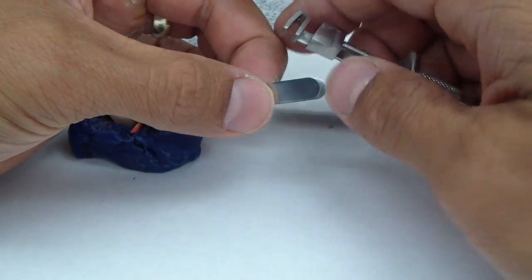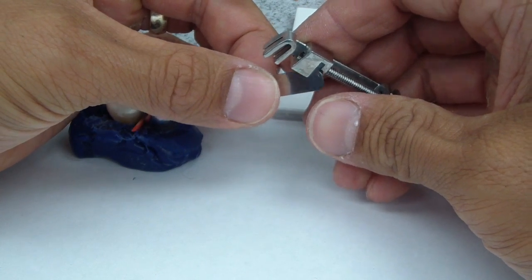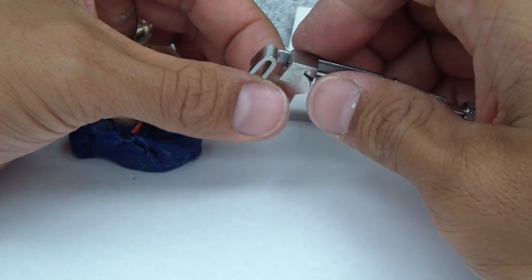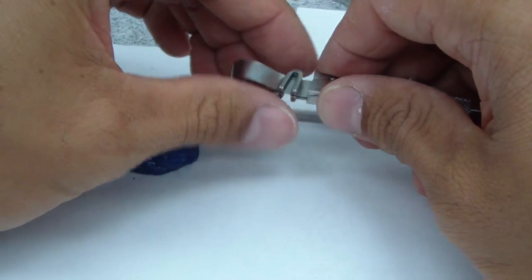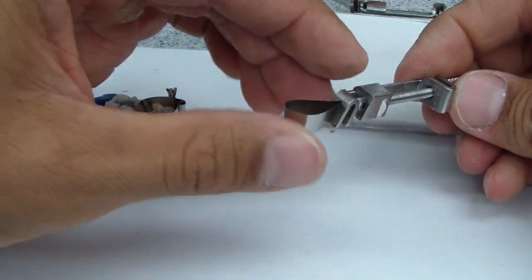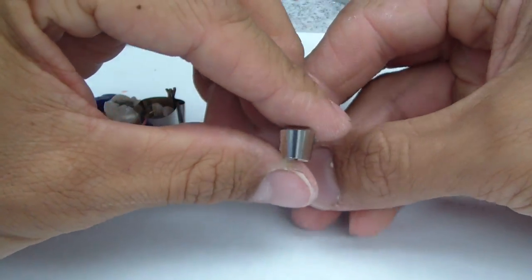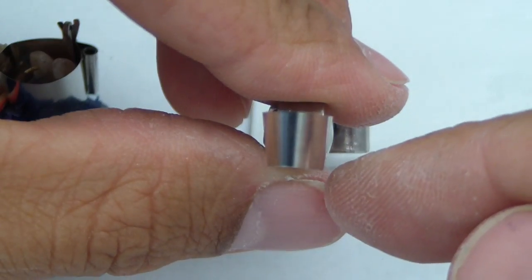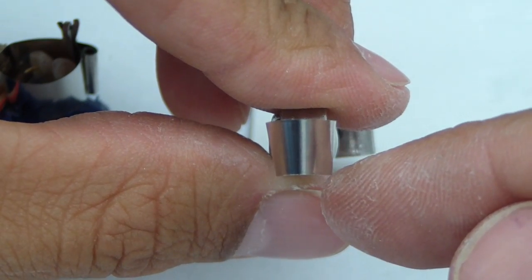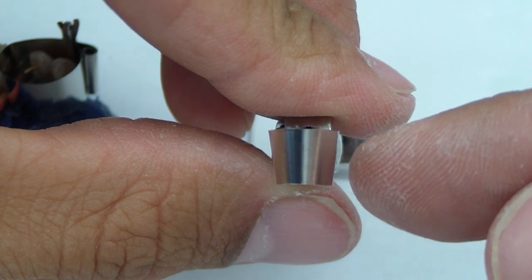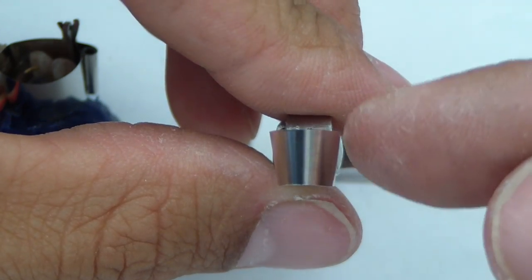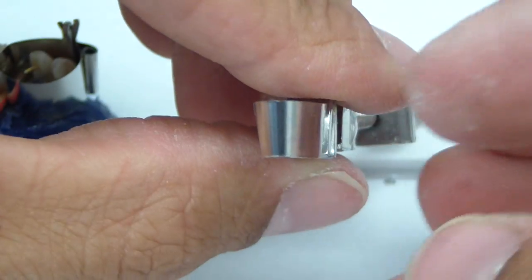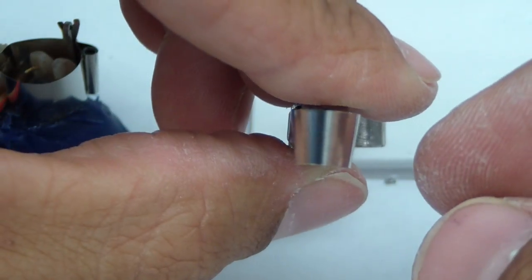Say for example our trusty Toffelmeyer, if you place it correctly, when you go to place it approximately, you sort of get a flat contour. And we're trying not to do that. I'm trying to get a nice contour from the top to the bottom, occlusal to gingival, also from buccal lingual, a nice contour, a contact area versus a point contact.